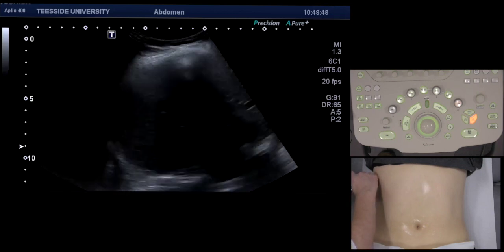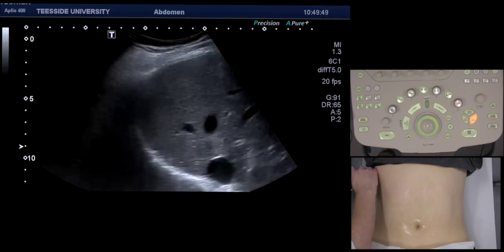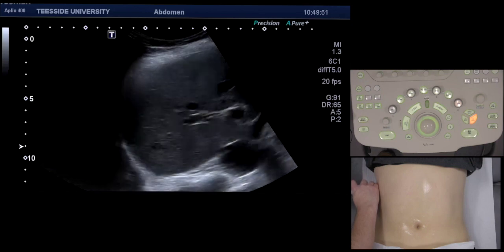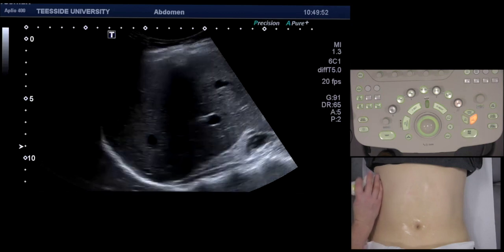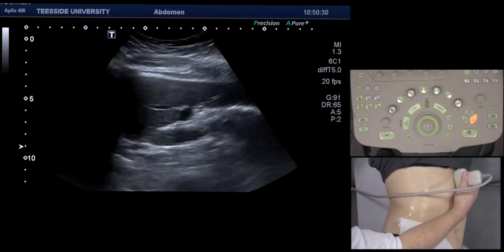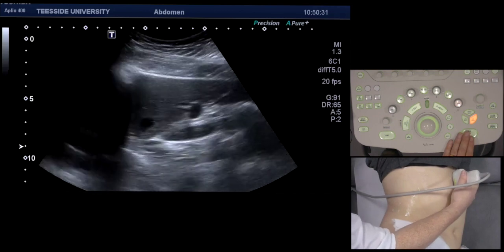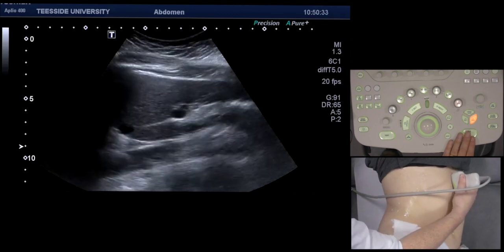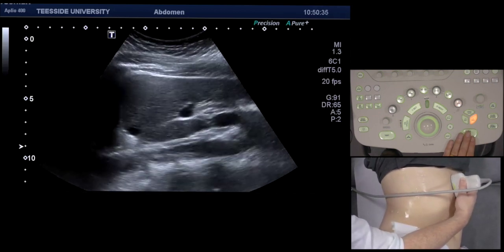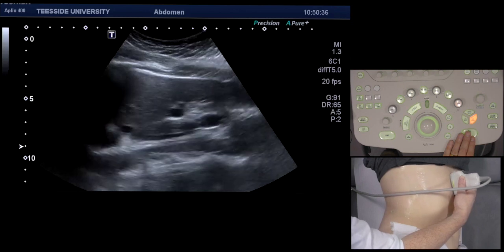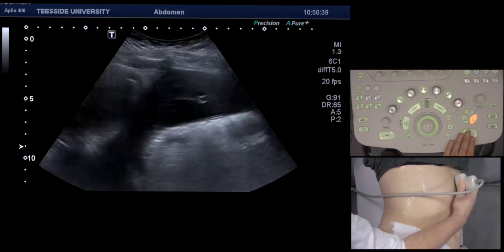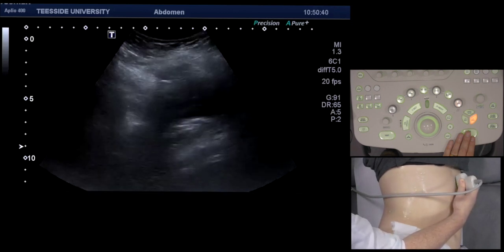The best view is actually when you turn the patient into the right anterior oblique position, which we've done here. Then I'm just repeating the whole process again, starting from the left lobe and then sweeping laterally.